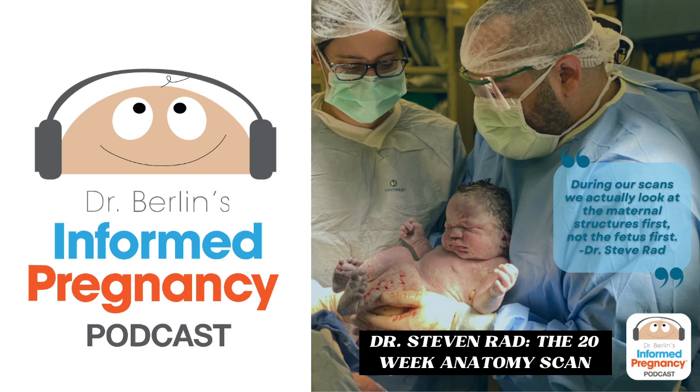Always in order. Okay, so when I'm looking at the fetal brain, we're looking at the shape and size of the head, and we're looking internally at the basic structures and making sure the brain, for example, is divided in half, and making sure the correct foldings are present, and the amount of fluid is normal. And I look at the cerebellum, which is the bottom part of the brain. We look at the neck fold, or the nuchal fold, and make sure all of that is looking good. Okay.